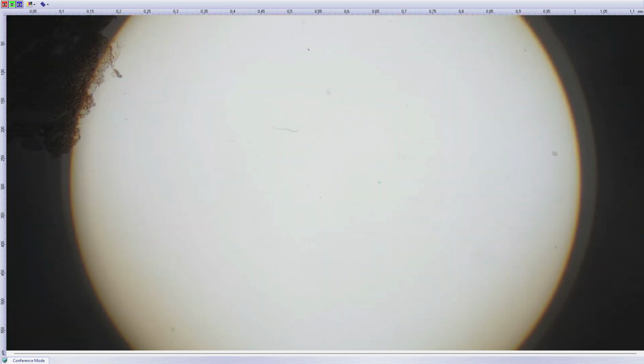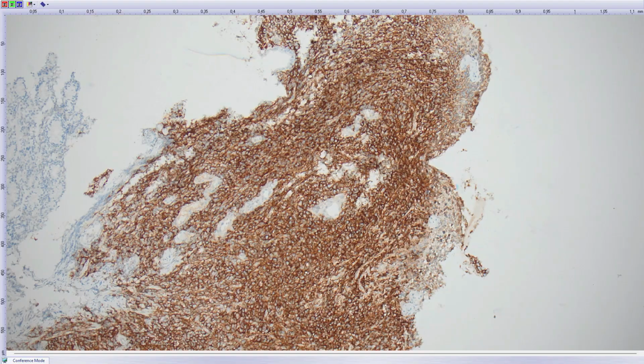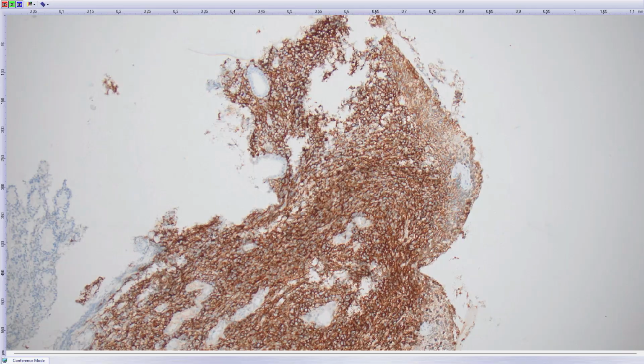And you can use the RAS immunohistochemical stain, which detects the most common NRAS mutations. It doesn't detect all NRAS mutations, but just the most common ones. And look, it's diffusely strongly positive. Then we found out the patient has a history of melanoma, so we didn't even do molecular. This is undifferentiated melanoma, most likely with NRAS mutation.